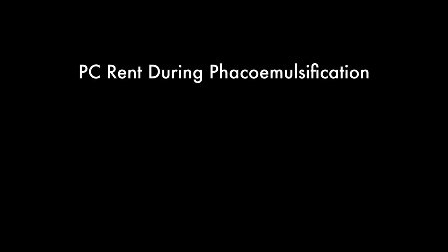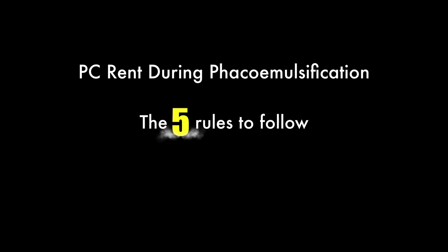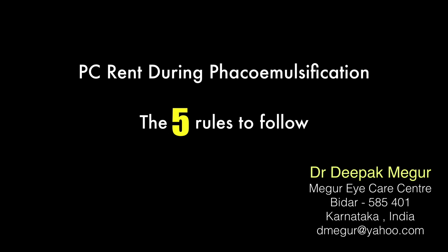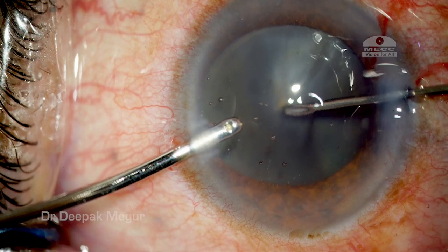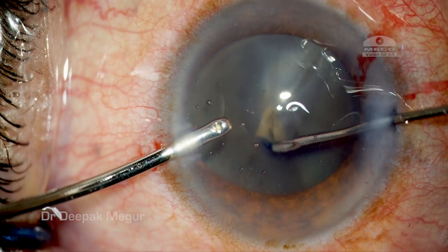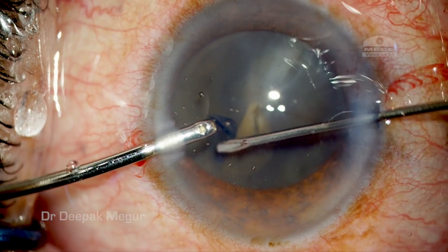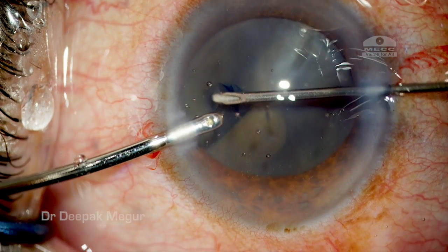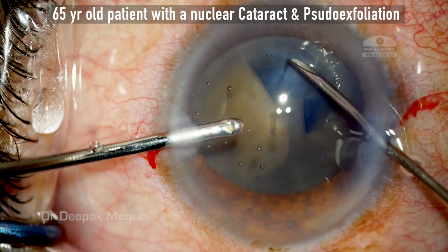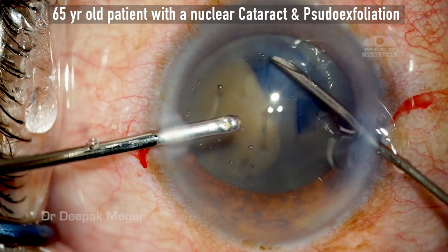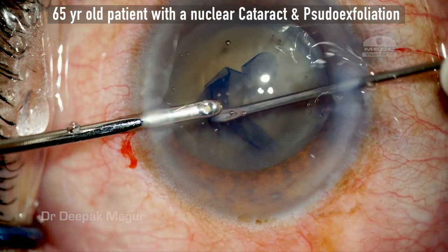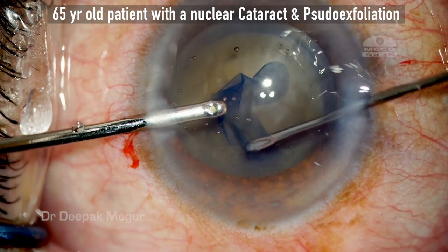Hi dear friends, today I'll be sharing a few practical tips on managing a case with posterior capsule rent during phacoemulsification and how to prevent a nucleus drop. This looks to be a routine case — a 65-year-old patient with a nuclear cataract.